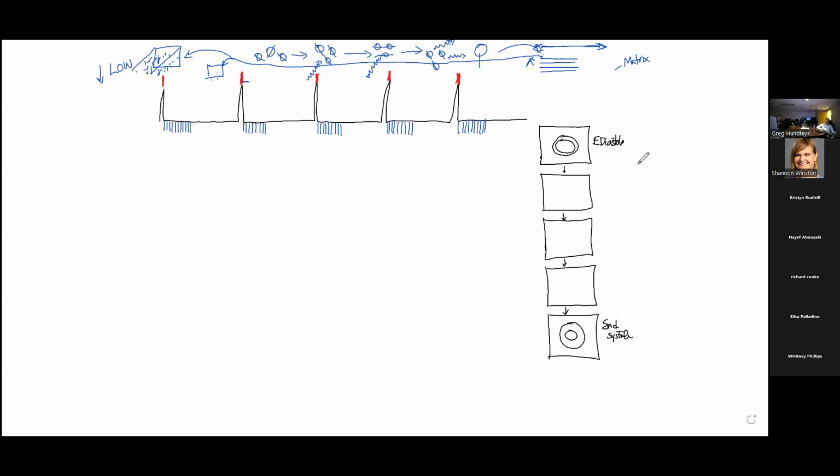And these are triggers, in this red here, that the scanner is going to recognize. So anytime we go into the scanner, we put on these leads because we've got to coordinate our picture taking with some repetitive signal. And we're going to, in this example, use the QRS complex. Okay? And so at each point in time, we're going to take a piece of information right here, and we're going to go over here and populate one of those lines of the matrix.